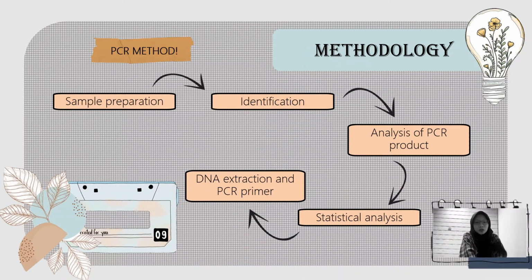For detection of bacterial pathogens, genomic DNA was extracted with the universal kit for bacterial DNA extraction, quantified by 1% agarose gel, and subsequently used as a template for PCR amplification. The universal primer pair GYRB forward and GYRB reverse was used for the amplification of an approximately 1.2 kb fragment of the bacterial GYRB gene.